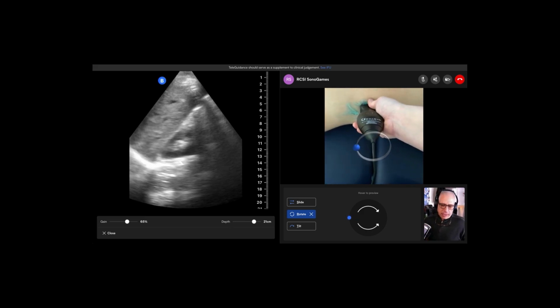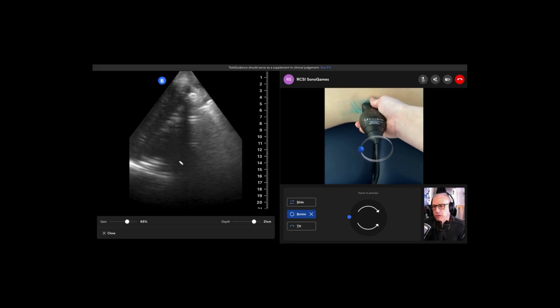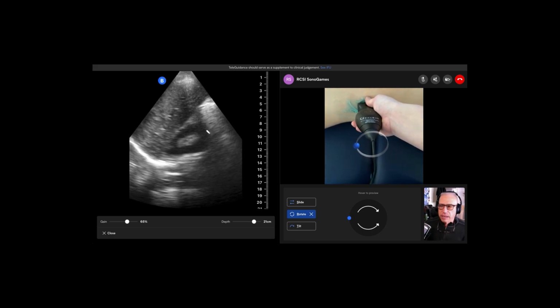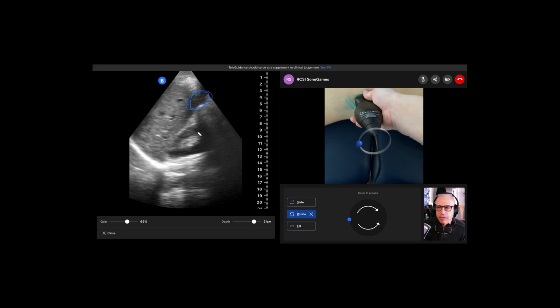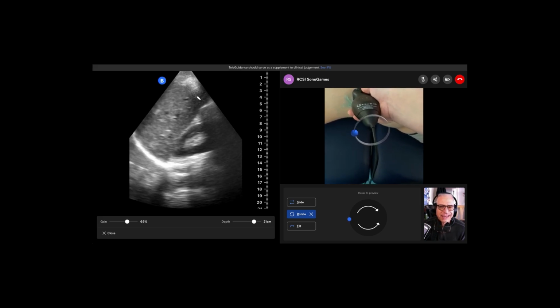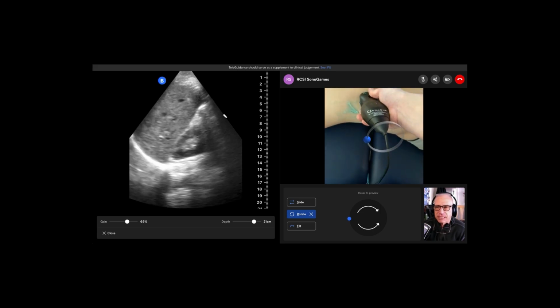If you're taking care of a woman who comes in hypotensive and atraumatic, of reproductive age, always a concern about ectopic, you will often see fluid here in this caudal tip before you'll see it in the pelvis. The idea is that for any adult with fluid in the belly for any reason, that's a really sensitive place.